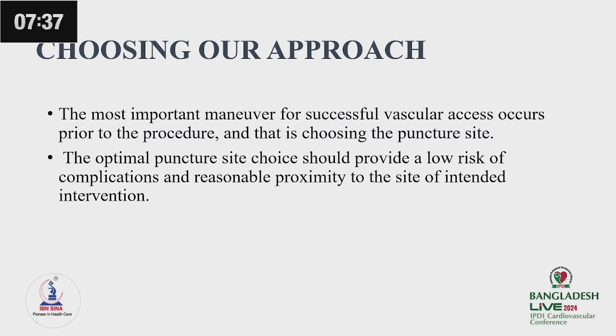At first, what approach should be chosen? The most important maneuver for a successful vascular access occurs prior to the procedure, and that is choosing the puncture site. The optimal puncture site should provide a low risk of complication and reasonable proximity to the site of intended intervention.